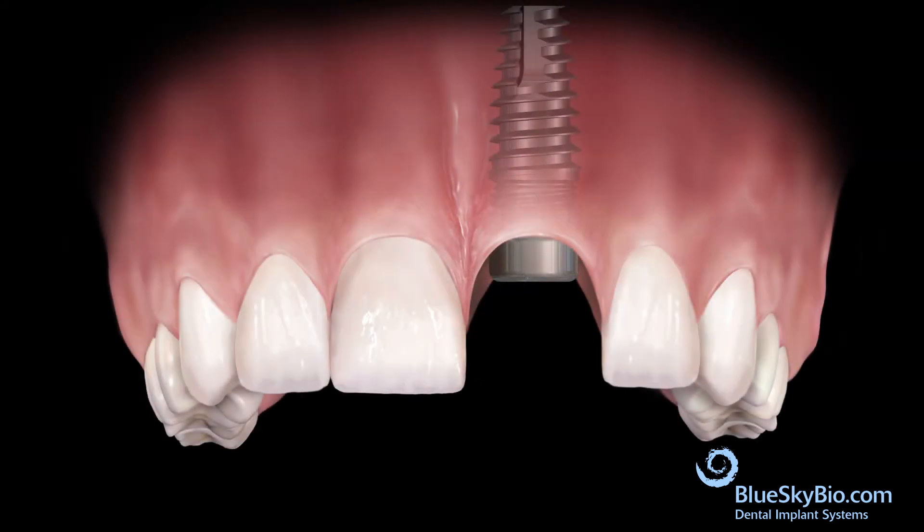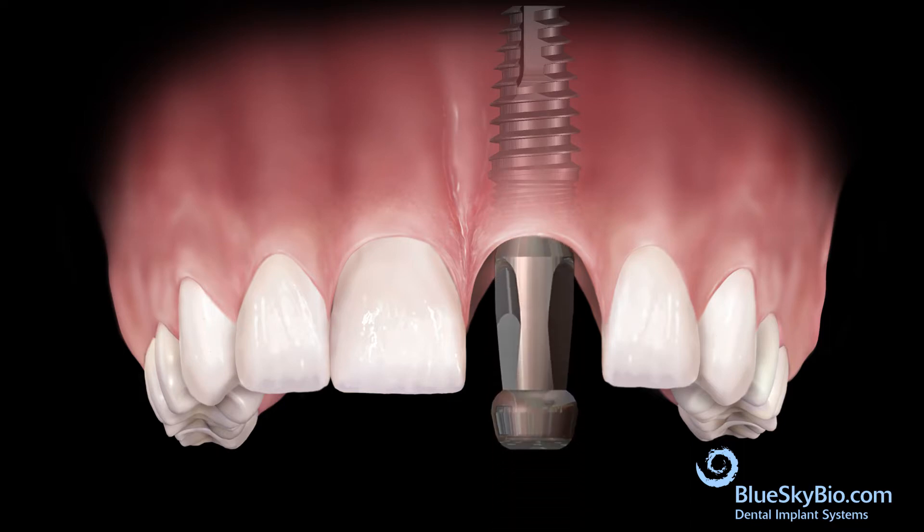After the implant is adequately integrated, remove the healing abutment and insert the impression transfer. It is important that the mating area of the impression transfer fully engages the mating area of the implant. Tighten the fixation screw only with finger pressure. Fill the top of the screw head with wax to prevent impression material from flowing into the head of the screw.